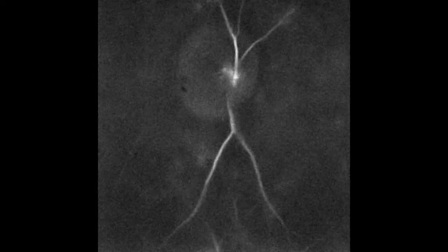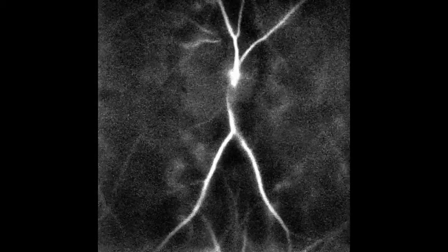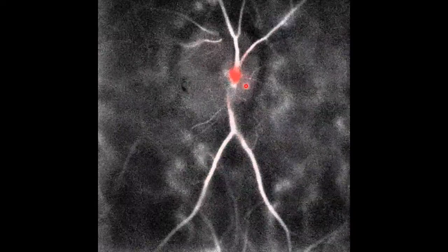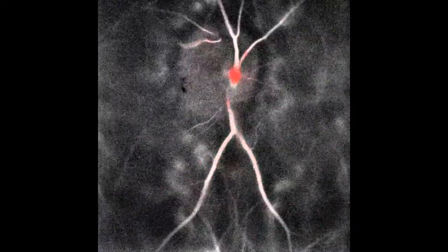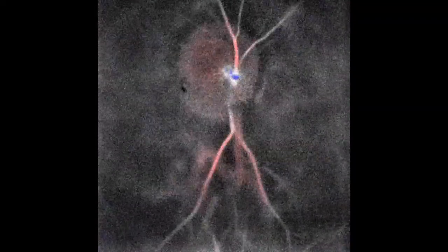We have a look again at the case of a very particular blood flow that we were presenting initially, and apply the directional blood flow contrast, and we see that in the retinal artery there is a change of color throughout the cardiac cycle, which is very unique compared to what we've seen so far, and it clearly reveals that there is a change of actual direction of blood flow. That means a blood flow reversal.